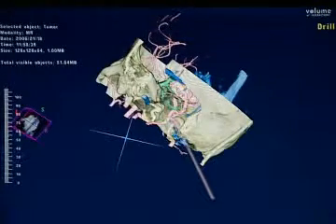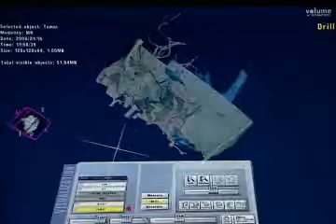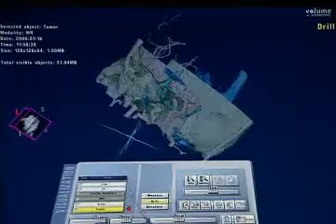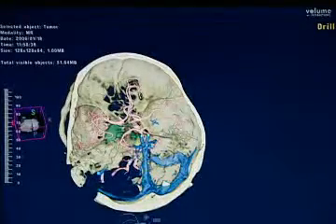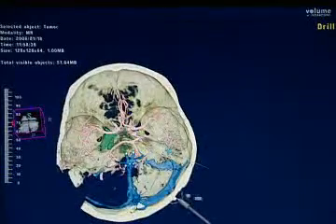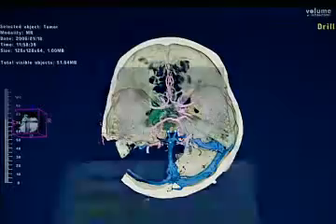Again, taking down the tumor and leaving, obviously, at the end of the day, looking at how much tumor you have there. And that's the amount of tumor that was left behind. As you can appreciate, this is the amount of tumor that was found over the cavernous sinus, which we had to leave behind, but removing mainly the large majority of the tumor that is compressing the brainstem. So this is something that we found very, very useful.